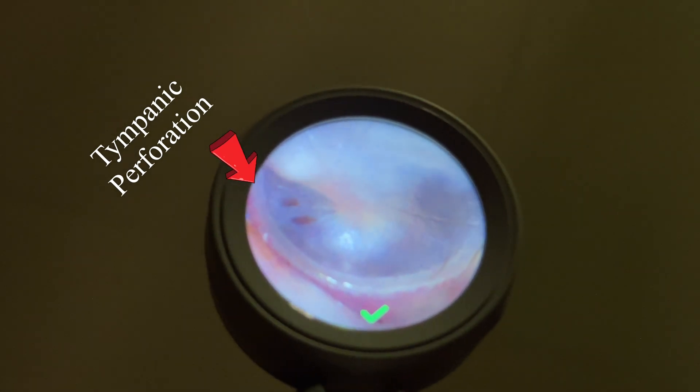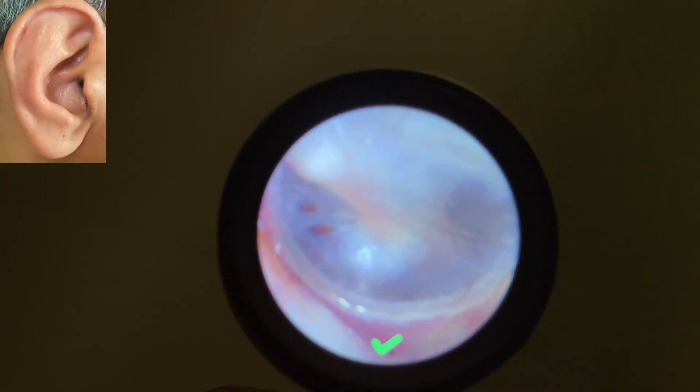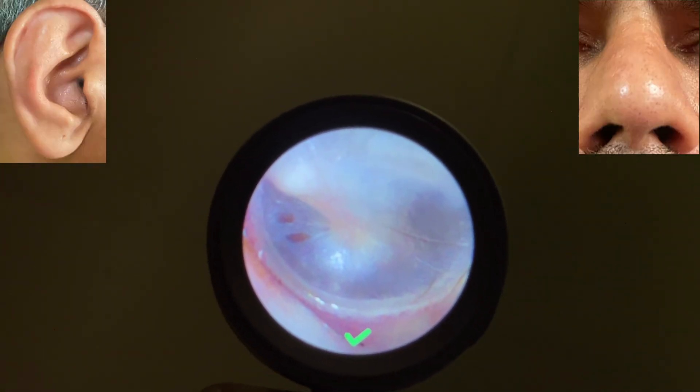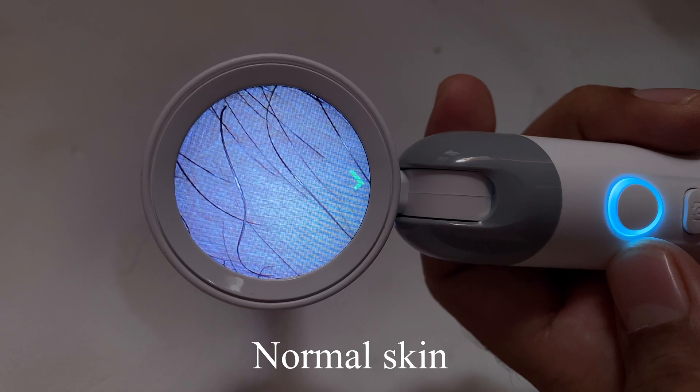Hi everyone. If you want to have a scope which is used for the examination of the ear like an otoscope, nasal examination, oral examination, and even to picturize skin lesions, then this instrument is for you.